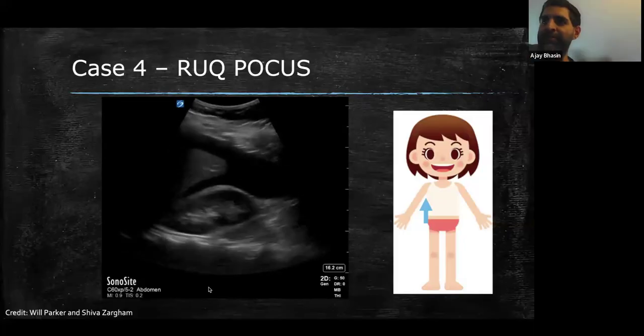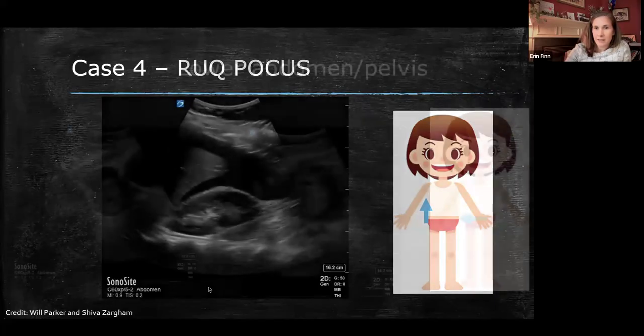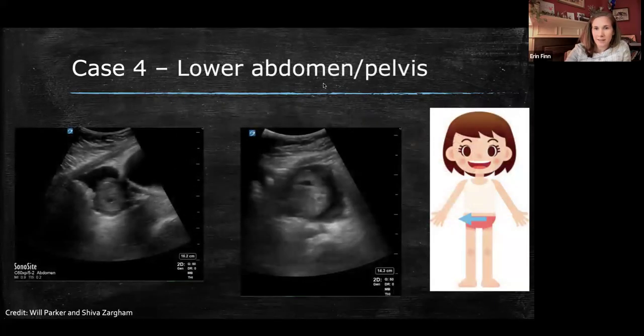We have one for lots of free fluid. Yeah, so lots of free fluid. So they're going to keep looking at other places in the abdomen. They liked the thought that y'all had about, could there be something going on with the ovaries?